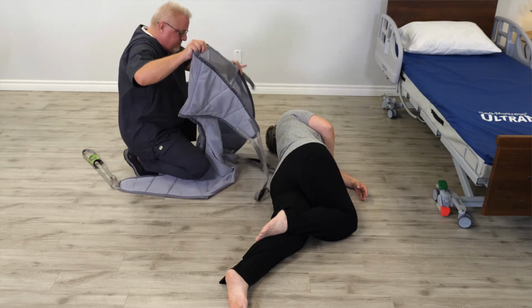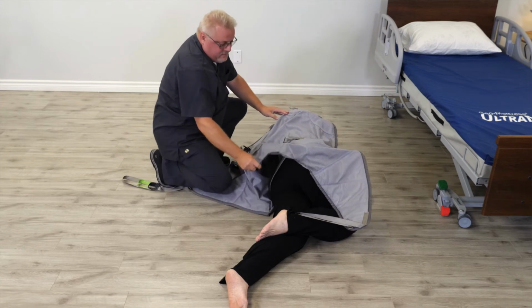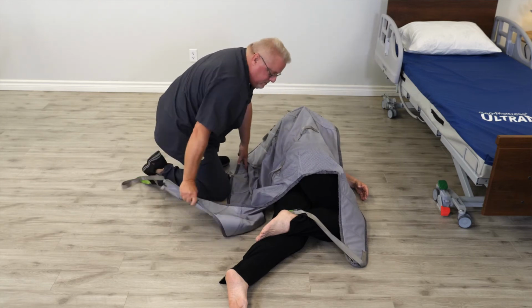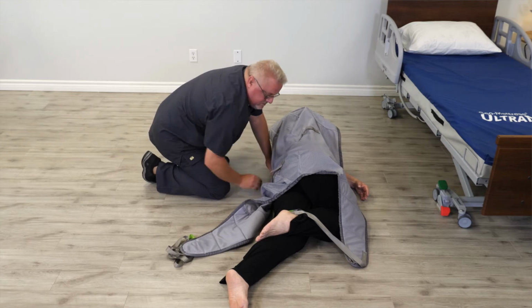Place the sling on the patient with the shoulder strap at the shoulder and the leg strap down the thigh. Line the center triangle sewn into the curve of the sling with the tip of the spine. You then tuck the excess material under the body and lay the patient flat.